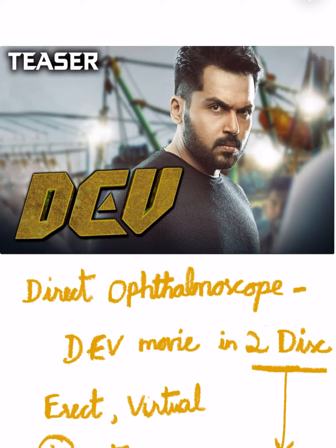In ophthalmoscope, we have direct and indirect ophthalmoscope. To remember the difference between the direct and the indirect ophthalmoscope, we have this picture mnemonic, the movie Dev, which was released in almost all languages and acted by Hero Karthik.